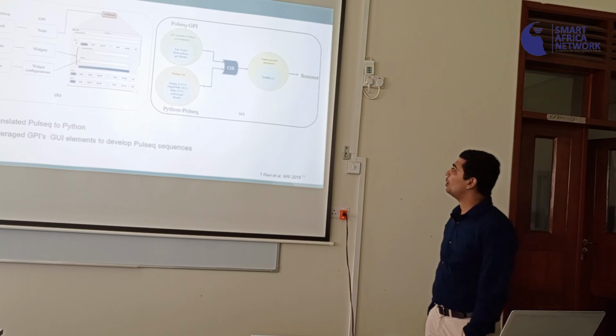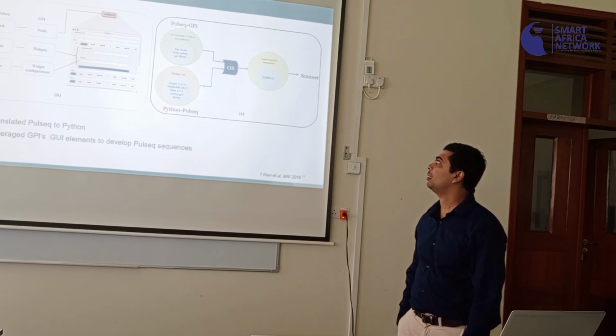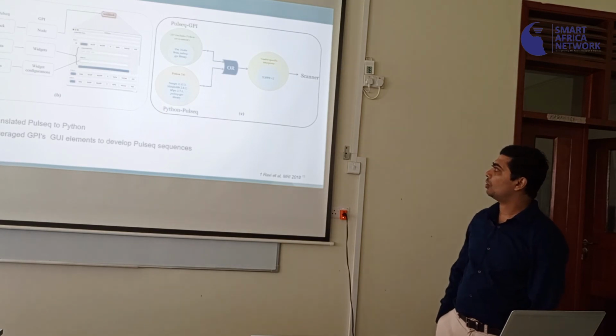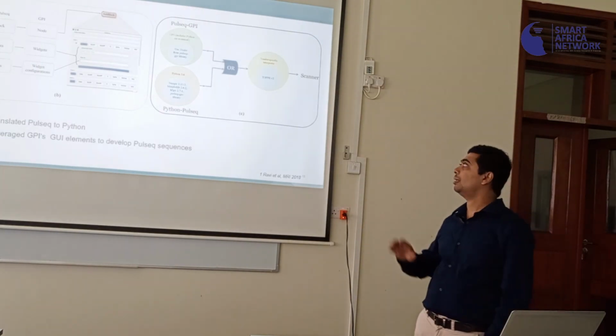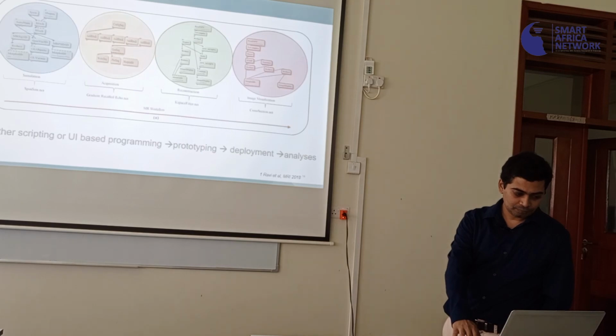So my PhD student started thinking about this and tried to get the Pulseq and the GPI together so that you could have the acquisition and reconstruction together. So he put these things in a way that the acquisition and the reconstruction mirrored each other.